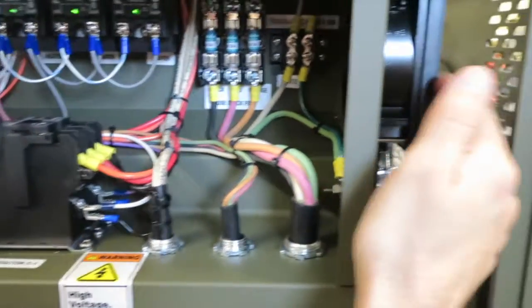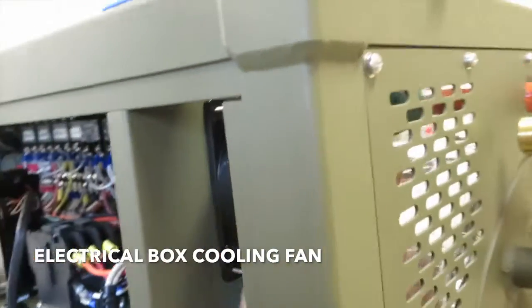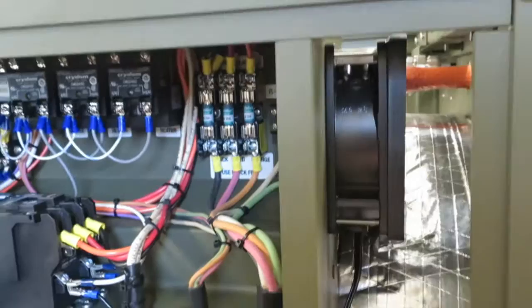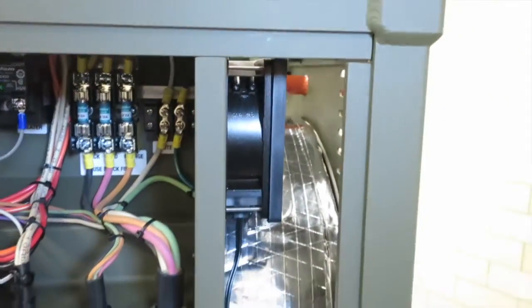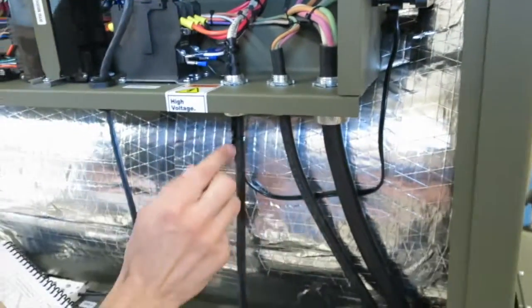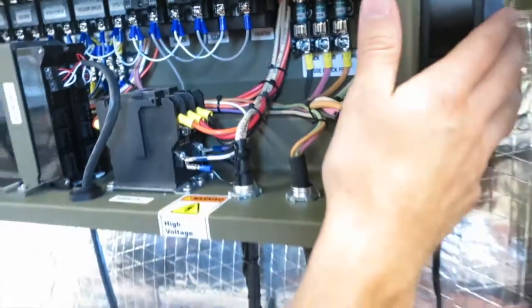Right here on the side we have the cooling fan. This draws air across all the electronics and actually blows it out the back to keep all the electronics cool during operation. So very good check. You can kind of put your hand there just to make sure air is blowing. The power for it comes down this cable and connects to the contactor. So right when you turn that on and off switch, it also sends power to the fan.